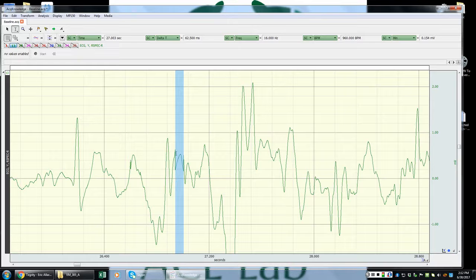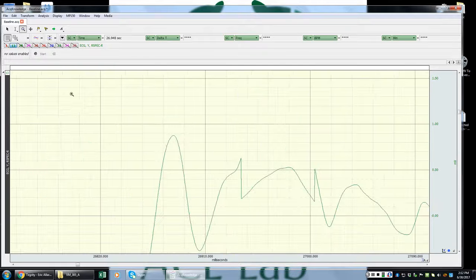Now, the fact that it looks a little goofy with these little peaks here, you don't really have to worry about that. As long as these are the more prominent peaks, the system is going to be able to identify it a little bit better. I might zoom in just a little bit to make sure that I'm really getting the bulk of this waveform right here. Okay? So what I'm going to do is I'm going to transform.